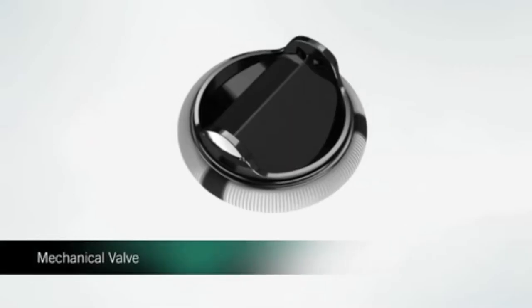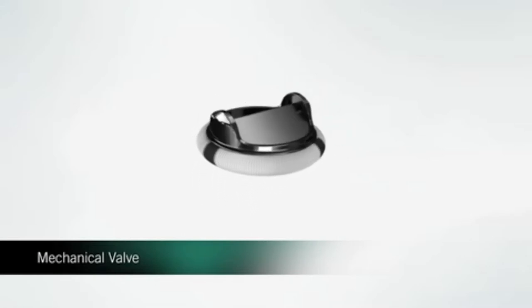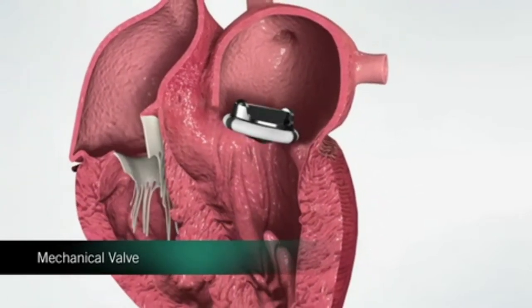A mechanical valve is carefully designed to mimic the natural heart valve. Like your own heart valve, the mechanical valve has a ring to support the leaflets that open and close with each heartbeat, permitting proper blood flow through the heart.